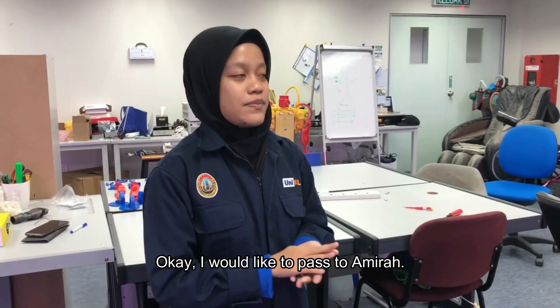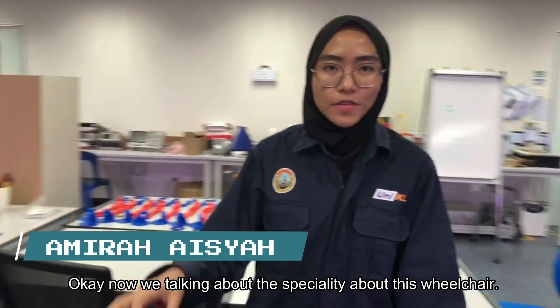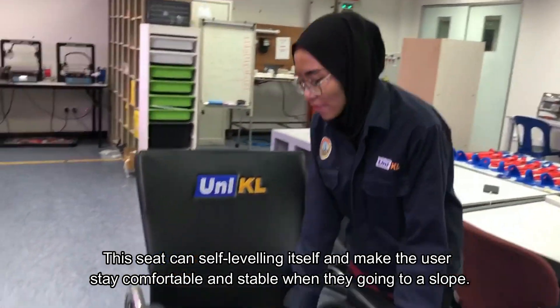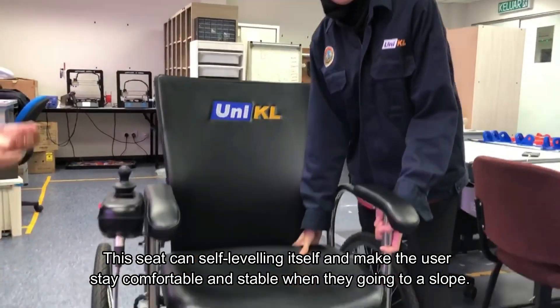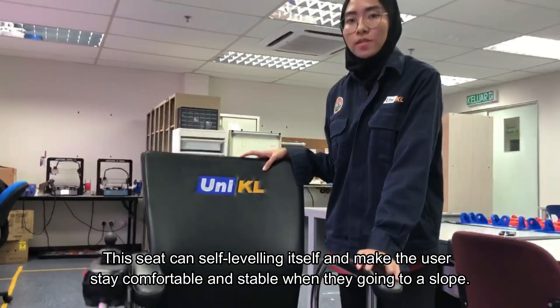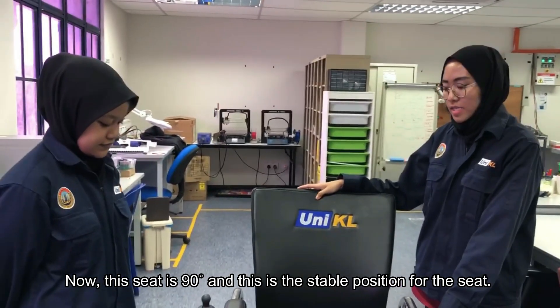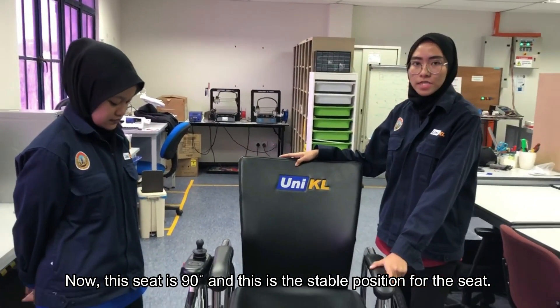Now I would like to pass to Amira. We are now talking about the special ability of this wheelchair. This seat can self-level itself to keep the user comfortable and stable when going on a slope. The seat is at 90 degrees, which is the stable position.